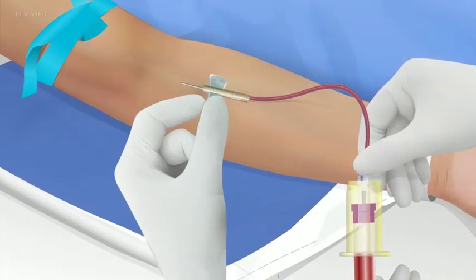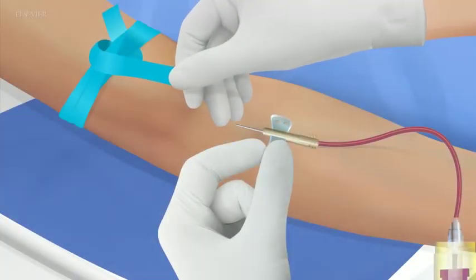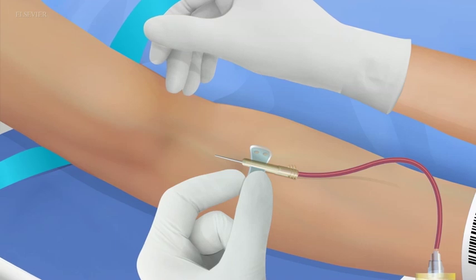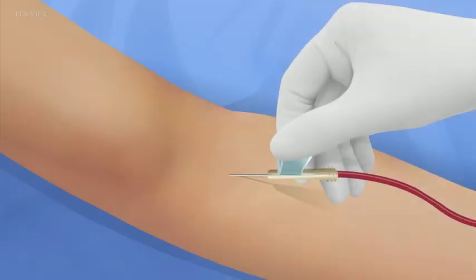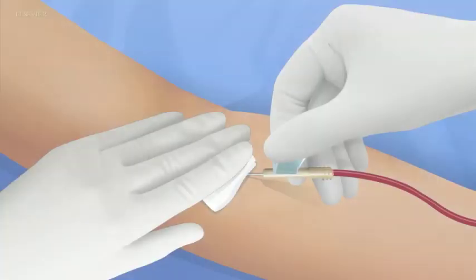If the blood flows sufficiently into the bottles or tubes, and if a tourniquet was used, release the tourniquet just before filling the last specimen tube or syringe. If blood flow is slow, wait to release the tourniquet until the last bottle or tube is almost full. Apply a sterile 2 by 2 inch gauze pad over the venipuncture site, but do not apply pressure.